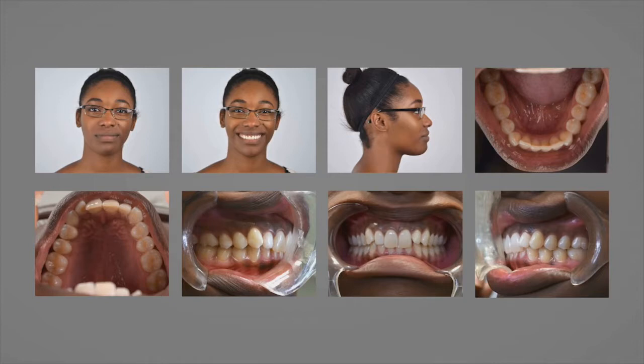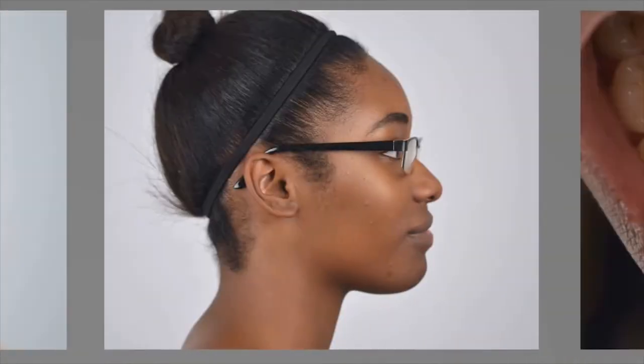Full face photographs should be taken straight on, with the patient's face filling as much of the frame as possible. For the first facial photograph, the patient should assume a relaxed expression while keeping their jaw in occlusion. For the second, the patient should look directly into the camera with a natural social smile. For the profile photo, the patient should turn 90 degrees to their left, your right, and look straight ahead with a relaxed expression, chin parallel to the floor.